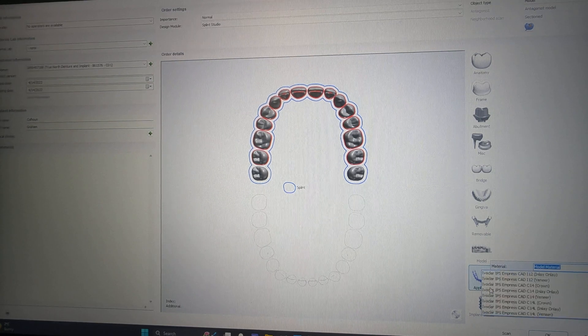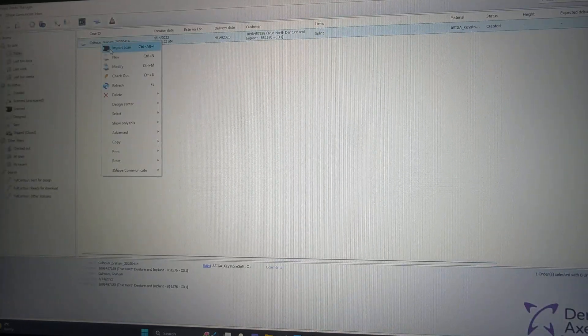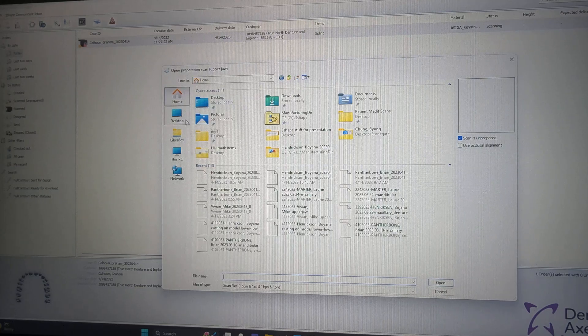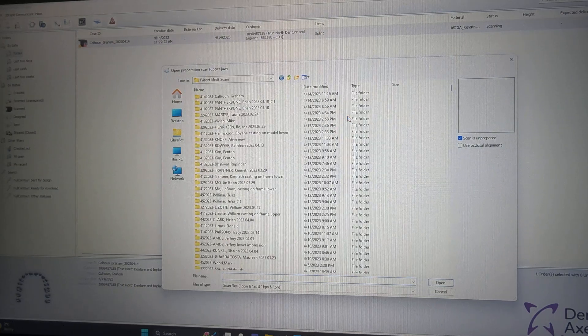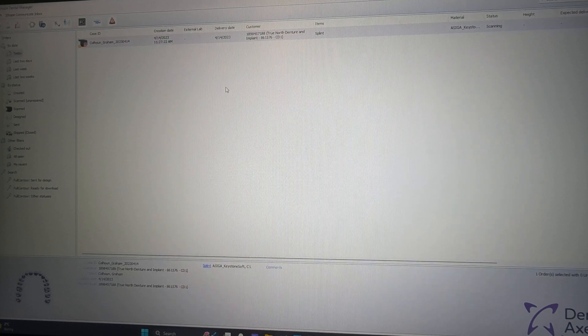We need to find the DMI file, bring in digital impression, click OK. There's our file import scan — it is in our library of Medit patient scans. Here we need the upper jaw. That's our upper and it will find the lower — click that. Off we go into Splint Studio.